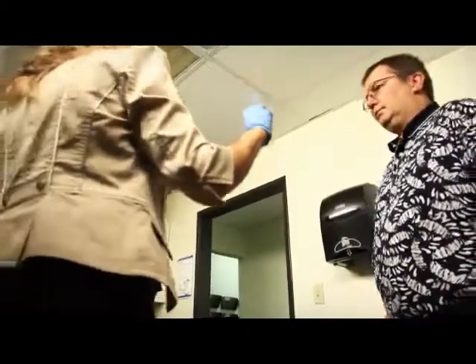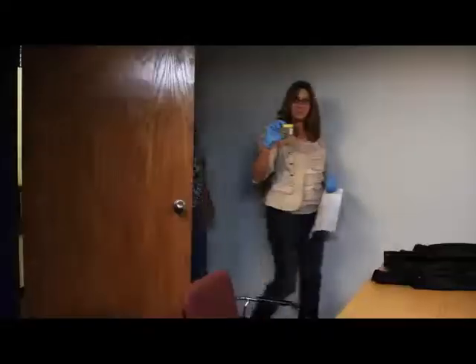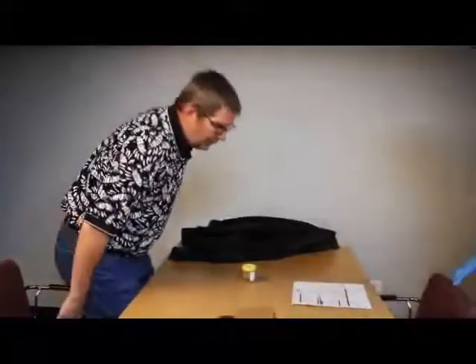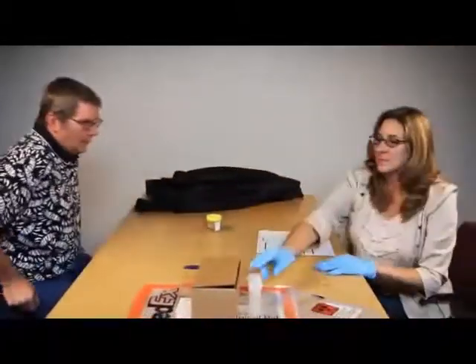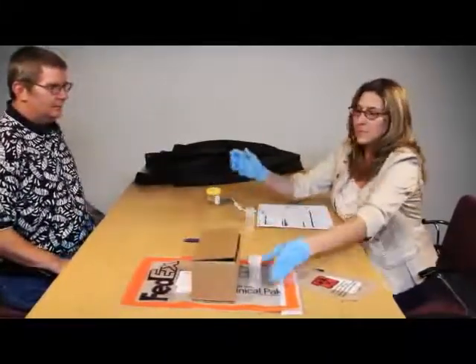Both the collector and donor will maintain visual contact of the specimen to the greatest extent possible until the labels, seals, are placed over the specimen bottle caps, lids. Unwrap or open the specimen bottles in view of the donor and transfer the specimen from the collection cup into the 2 specimen bottles.